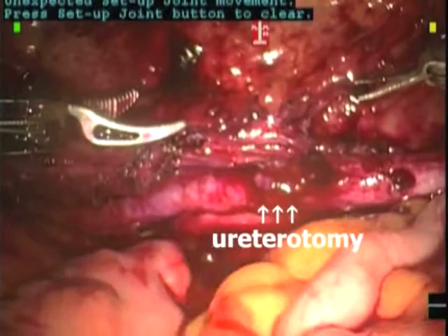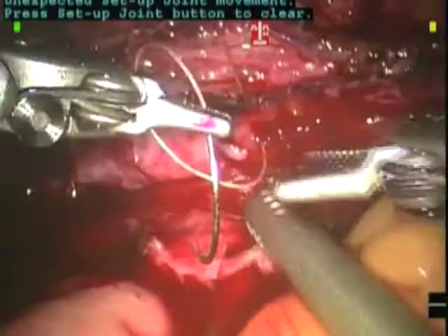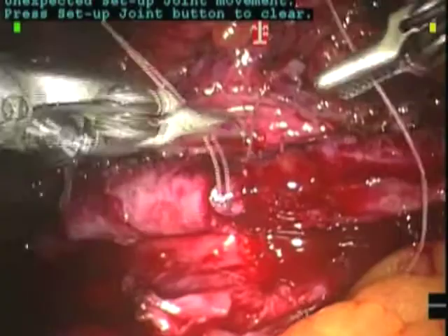Here you see an inadvertent ureterotomy that has been created in the anterior ureter. We always recommend repairing this with 4-0 Vicryl RB1 suture versus leaving it open, such as the Davis intubated ureterotomy principle. The ureter's blood supply has been compromised and therefore closure should be performed to prevent any problems with healing.